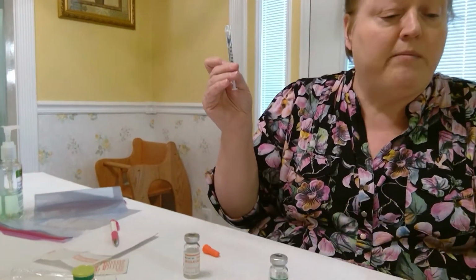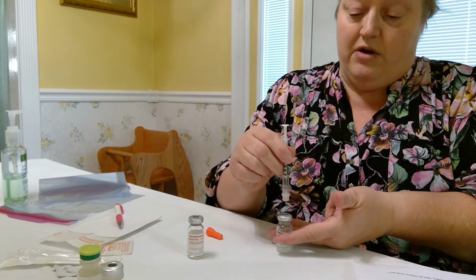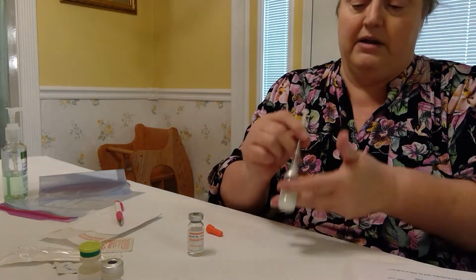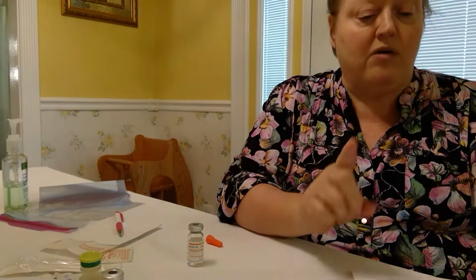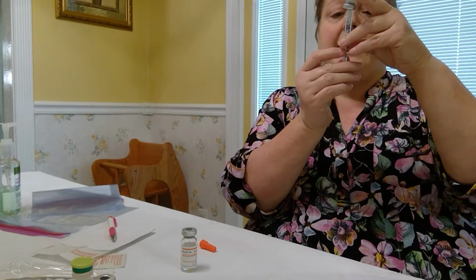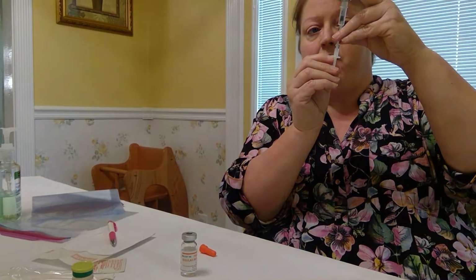Next, I'm going to draw up my 32 units from my NPH. Without depressing the plunger, put it into the bottle, invert it again, and now I'm going to add my 32 and 16 together and have a total of 48 units. So I'm going to be slowly pulling down to the 48 mark.